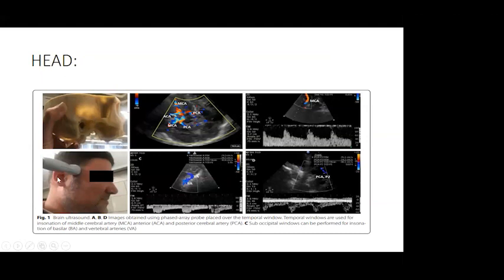So there are many conditions which we may be able to identify and diagnose using transcranial ultrasound. We can diagnose intracranial hemorrhages, intraventricular hemorrhages, midline shifts. We can assess the various vasculatures. You can use the Doppler to assess the vessels, the middle cerebral artery, the circle of Willis, wherein we can triage patients to find whether they are prone to or have developed intracranial hypertension. Based on this, we can even assess whether a patient is prone to or has cerebral vasospasm in cases of subarachnoid hemorrhage, to know the flow velocities and the decrease in the diastolic velocities in assessing a patient with decreased cerebral perfusion, as in a diagnosis of cerebral brain death, and so on and so forth.